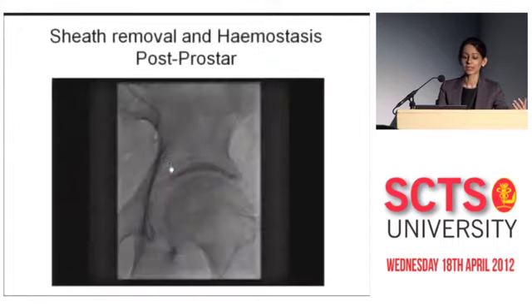Now, of course, once the sheath is in, if you have caused any damage, the sheath is usually occlusive. We're anticoagulating our patients, but it's not until the end of the procedure, when we withdraw the sheath, that vascular complications come to light. And so at this point, there has to be a high level of attention for the possibility of a tear, a leak. And it's often useful to take, again, a contralateral access to your artery. So when you withdraw the sheath, if you are worried about vascular injury, you're ready with your peripheral intervention kit to take the necessary action.